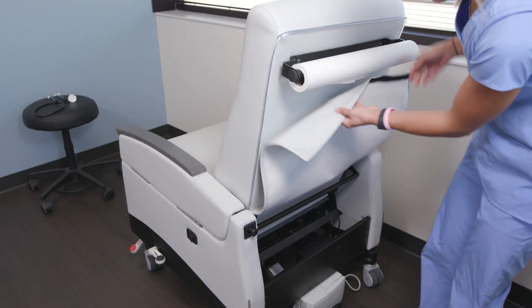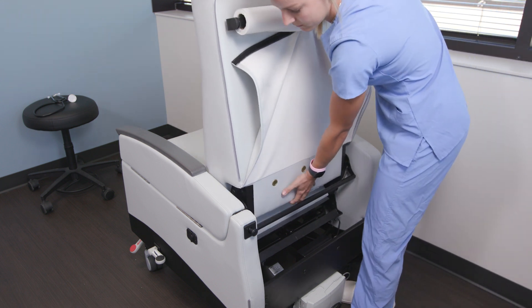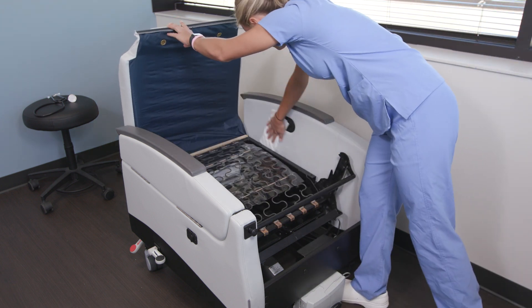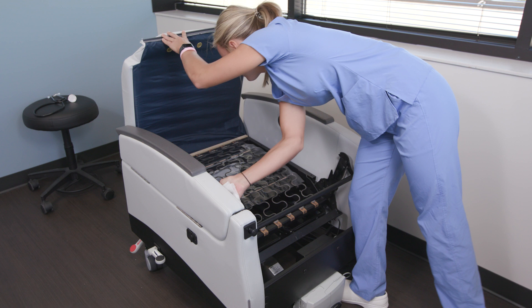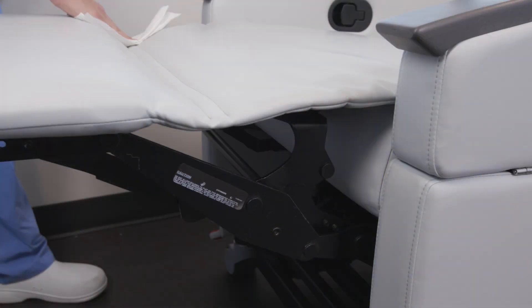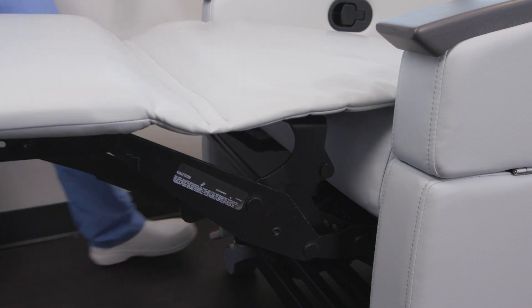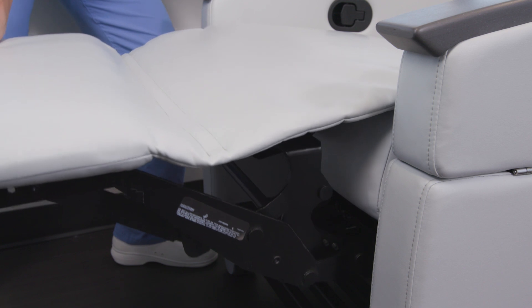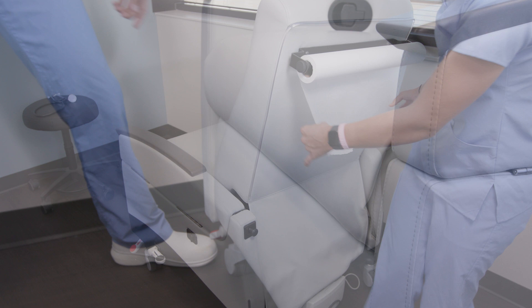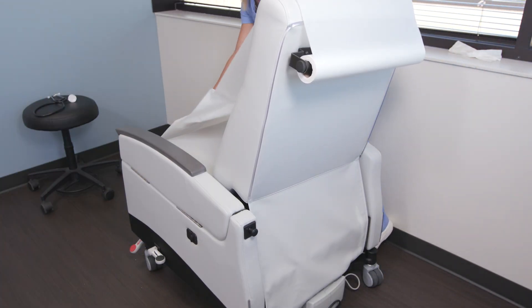The Exam Lift Treatment Recliner was engineered from the ground up with ease of cleaning and sanitation in mind, further promoting safety of patients and caregivers. The quick-release back and lift-up seat allow unhindered access and visibility to all surfaces with no entrapment areas to catch liquids. The Chase continuous leg support feature is also designed to aid easy cleaning and folds into the recliner in a deliberate way that avoids trapping debris. Once sanitation has taken place, a clean sheet of examination paper can be pulled from the optional paper roll holder in preparation for the next visit.